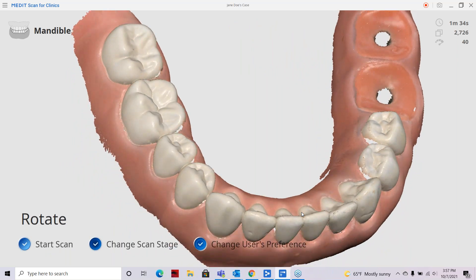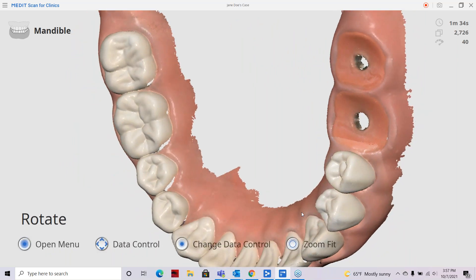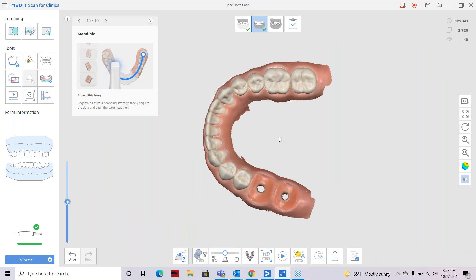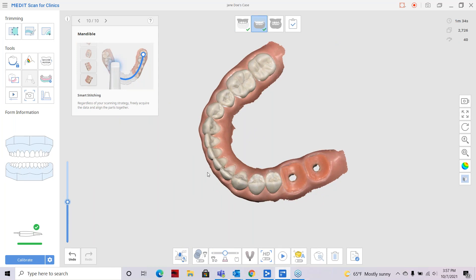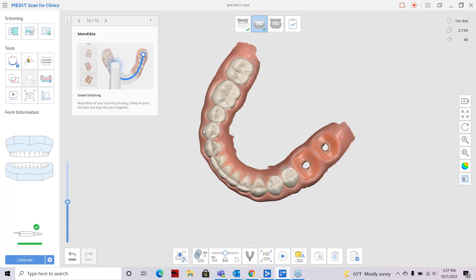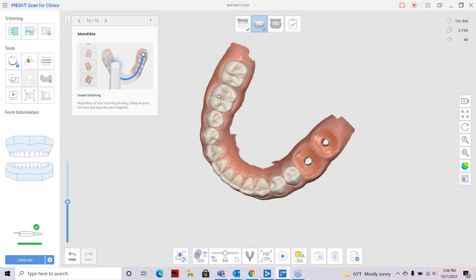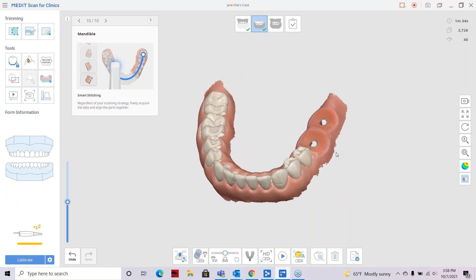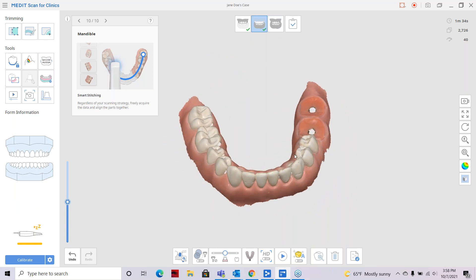Now we're going to talk about filling the major holes. To exit remote control mode, long-hold the remote control button, then click right to open settings or click left to exit. Back in basic scan mode: when filling holes, make sure the holes being filled by the software are not in a vital area — such as on a prep, a margin, contacts to a prep, or adjacent teeth. If you're doing a restoration, those areas provided to the laboratory need to be extremely accurate.